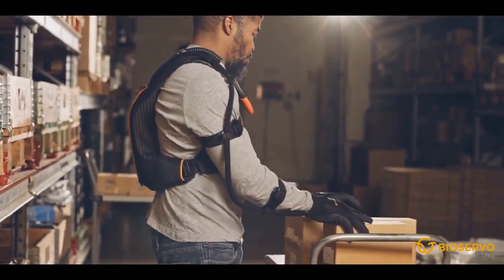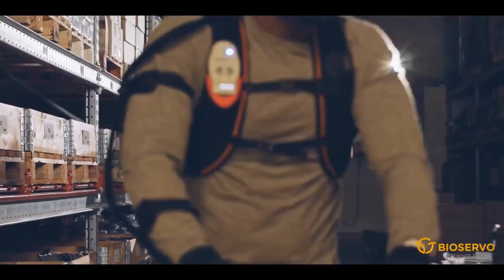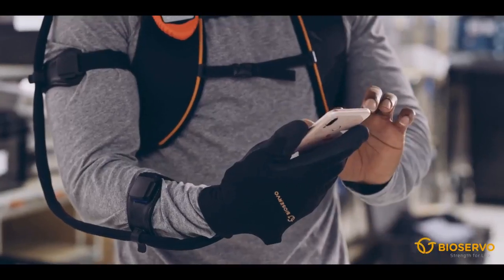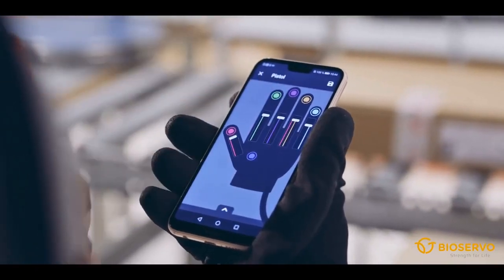The smart assist function learns from the user and adapts its settings to the work tasks being performed. The glove can also be configured to suit specific work tasks and individual preferences.